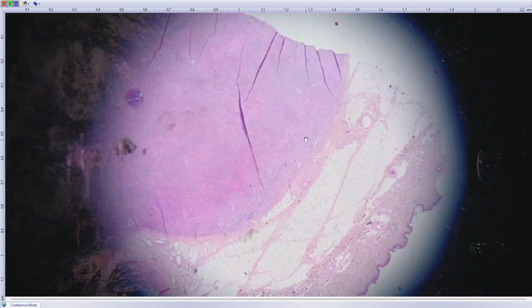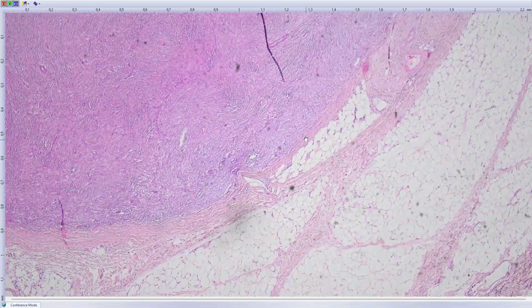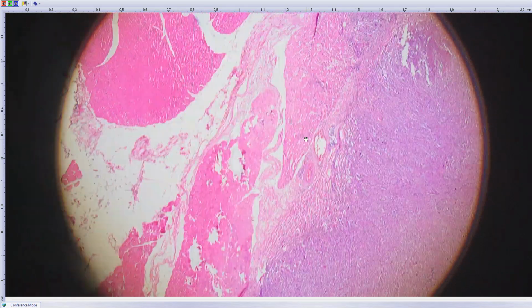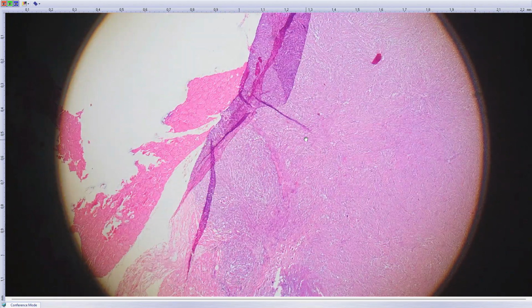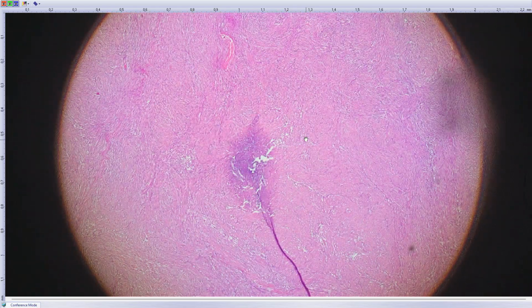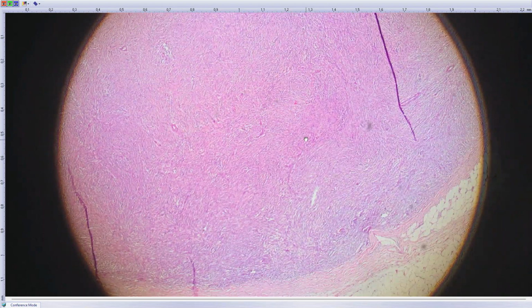Okay, next case, a 42-year-old male with a tumor on his forearm, which was deemed to be malignant, both clinically and by MRI imaging. On low power, it also looked to me quite possibly like a sarcoma, with infiltrative growth. It was infiltrating into skeletal muscle. There were also satellite nodules of this tumor in other sections. The tumor is, of course, very cellular.